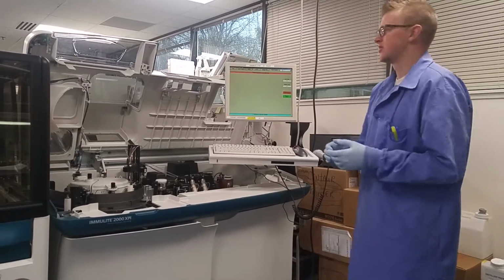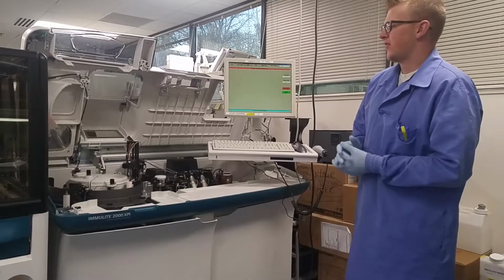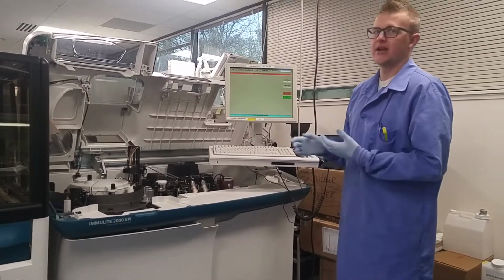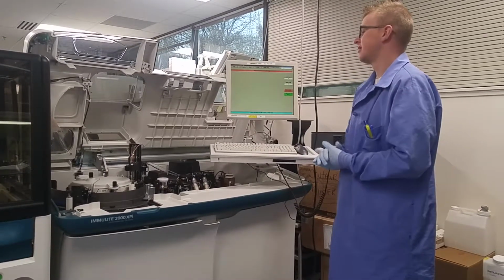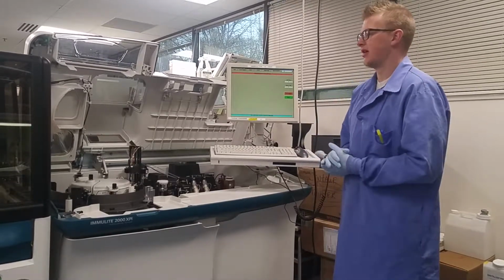Alright, so now the message is switched to filling transducer cavity with fluid. You'll let it run for about 30 seconds or so in an actual Clot situation, and then you go ahead and hit stop. Or actually press to end program. So press to end, give it about 30 seconds to refill up that reservoir, and then proceed on to the next step.